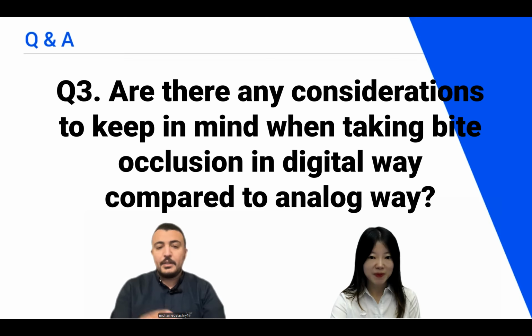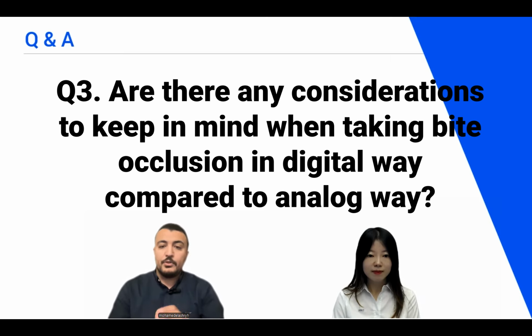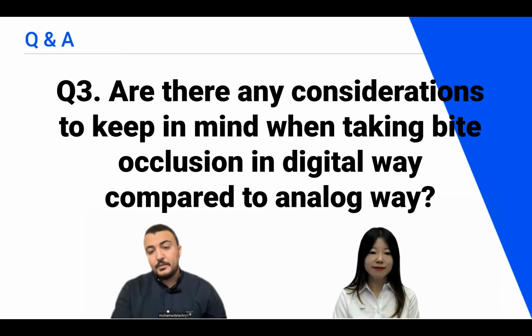I think this one was really a clinical tip. Yeah, I have many clinical tips in the webinar for each situation, for static rehabilitation cases, for Jaw Motion software, how to use it, and what the main benefits of Jaw Motion software are. Also for implant prosthetics, for the single tooth and complete mouth, how to use the Jaw Motion software to make sure that you have ideal occlusion or ideal occlusal contacts, especially for implant restorations. I think occlusion is a key part to reduce chair time and everything. Yeah, occlusion is a very important thing, starting not only from the final prosthetics, but from the diagnosis.